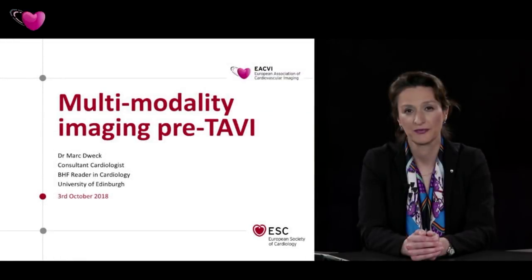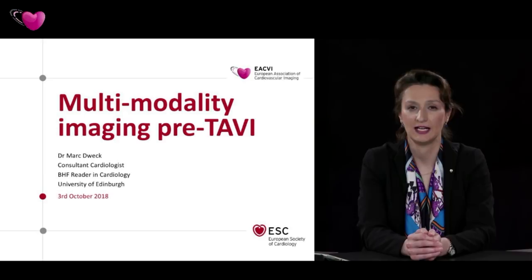At the end of this 60 minutes live event, you will be able to select the various imaging modalities to get the diagnosis of severe aortic stenosis right, how to select patients for TAVI and use multimodality imaging to optimize the procedural results and minimize the complications, and to understand the acquisition and post-processing of 3D datasets.